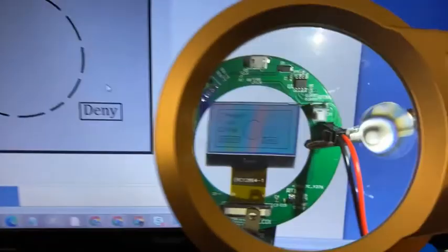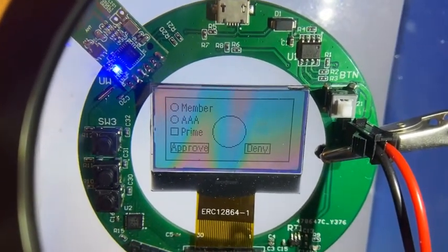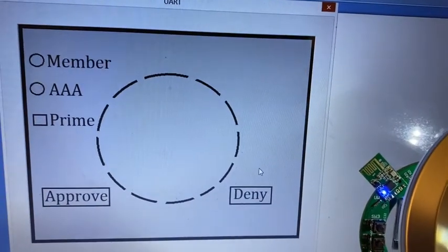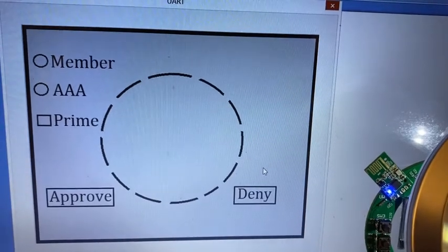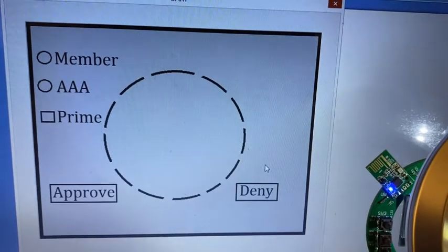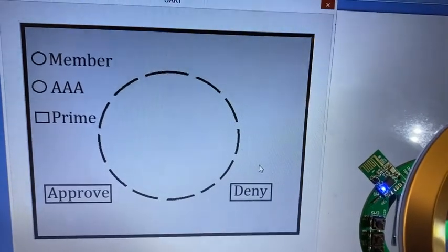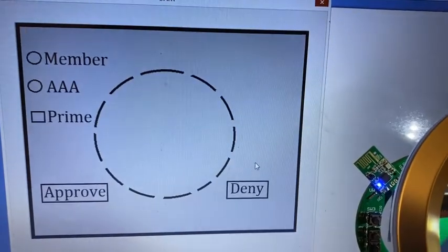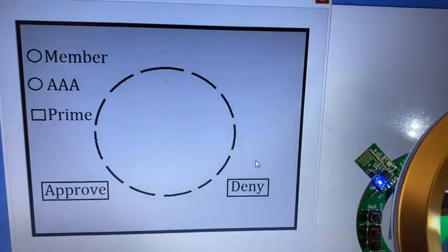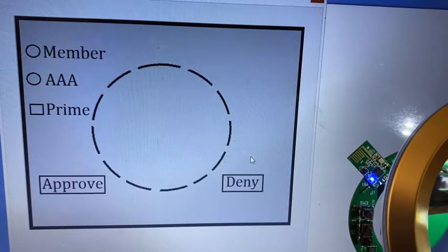Now, you can see, by the way, that the embedded display in the contact lens has the same image as what we have on our computer. Using the same technology that was described previously, the user can attempt to refocus on, for example, the UI component prime if he wants to select the checkbox. The system is going to use the user's eye as a pointing device, and will allow the user to simply focus on the checkbox.